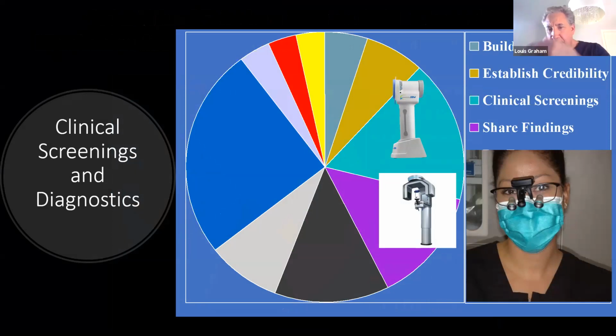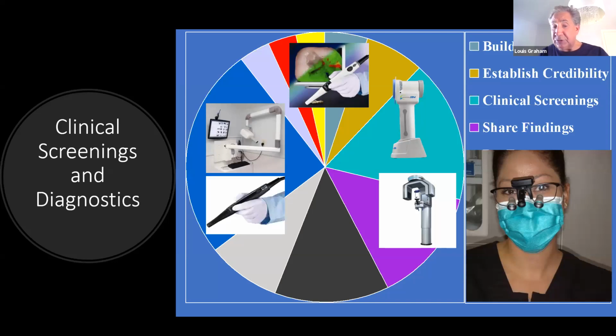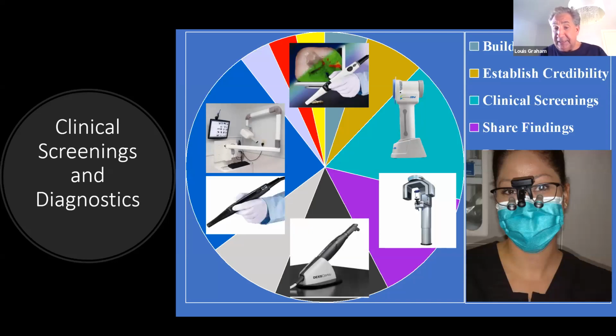Oral cancer screening is one of our 3 steps in oral cancer prevention and evaluation every time. Whether we're using Spectra, whether we're using 2D x-rays, whether we're using an intraoral camera, or we're using CariVu, all of these things come into clinical exams, all of them. And this doesn't even include saliva exams and other things like that. But again, these are our routine diagnostic tools.